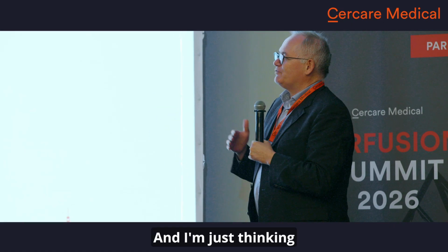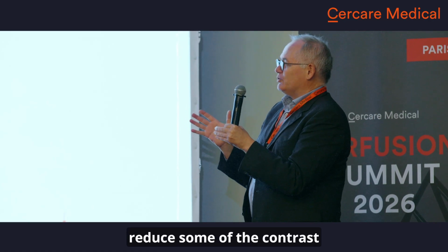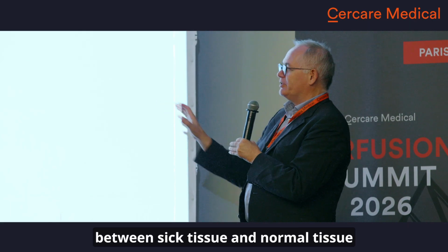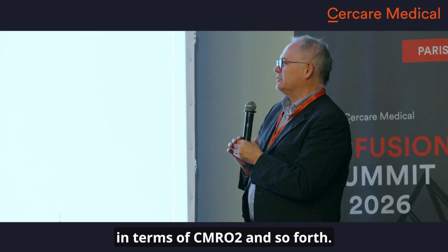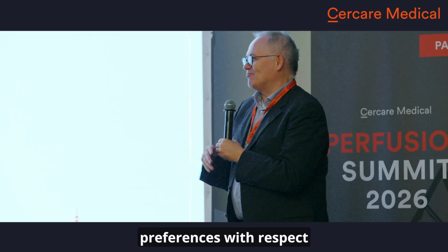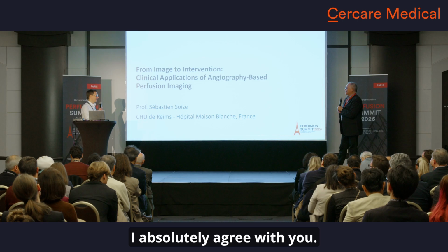I'm just thinking that you may essentially reduce some of the contrast between sick tissue and normal tissue, because all of a sudden you're in a different condition in terms of CMRO₂ and so forth. I just wonder if you have any thoughts, I know patients have preferences with respect to being anesthetized or not. First, I absolutely agree with you.